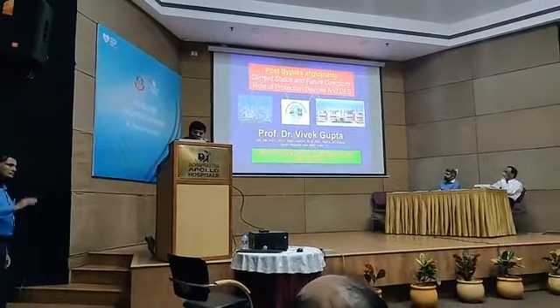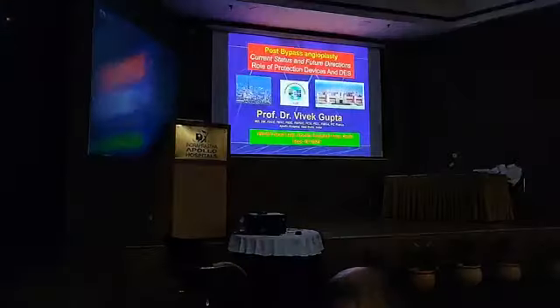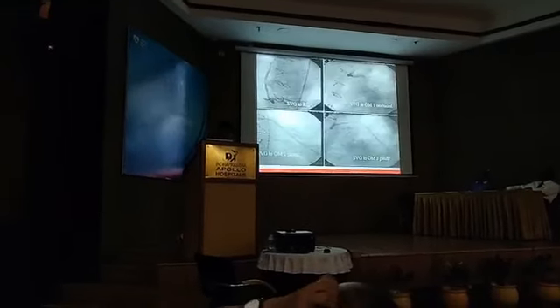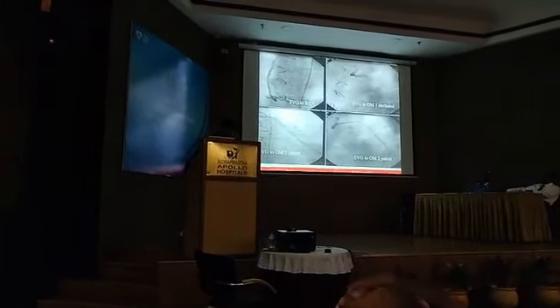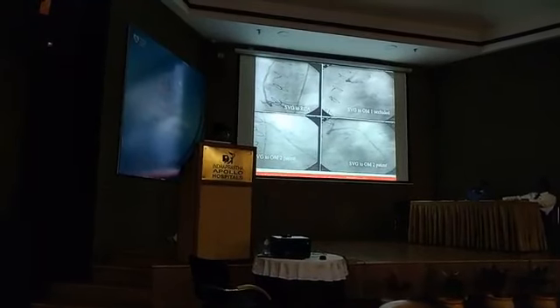So, post-bypass angioplasty: what is the current status and future directions, and the role of protection devices, on World Heart Day, 29th. These are the regular features of coronary angiography post-bypass. You can see RCA is occluded, the left anterior descending artery also has disease, and then you see this graft, saphenous vein graft to RCA, OM occluded, OM2 patent. These are the regular features when we do angiography post-bypass after a few years.